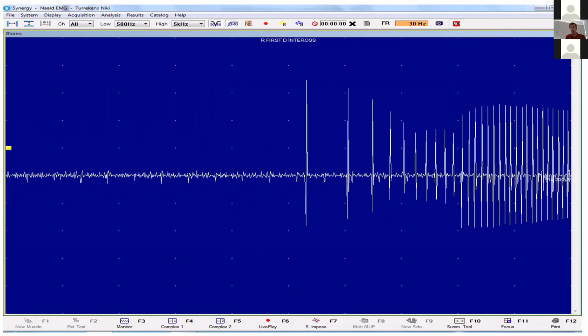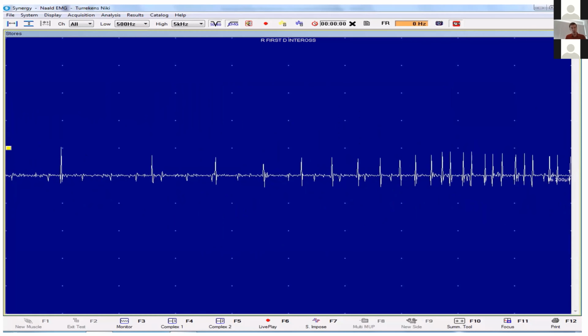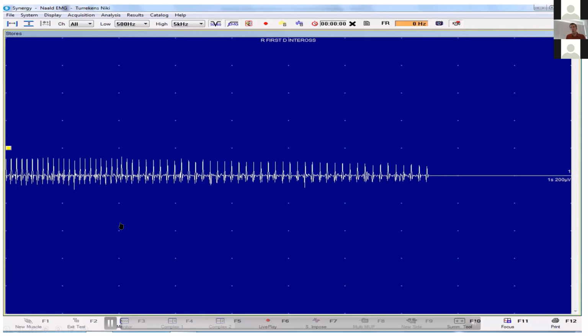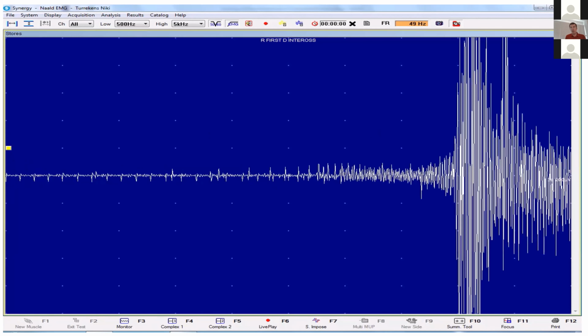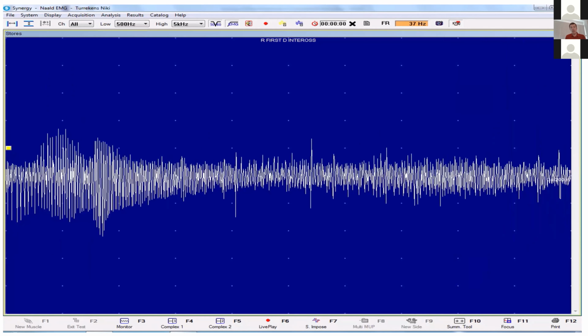The sweep duration is 1 second. The sensitivity is 200 microvolts. If we count how many divisions the myotonic discharges have, it's 4 to 5, which means that they go up to 1 millivolt. The amplitude of the fibrillation-like discharges is between 400 microvolts and 1 millivolt. The frequency is between 60 and 80 Hertz.